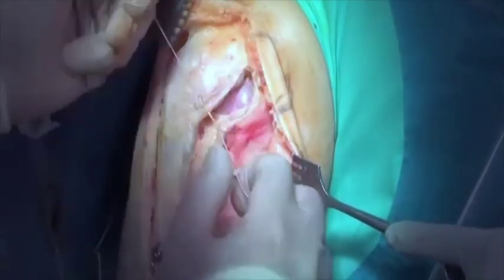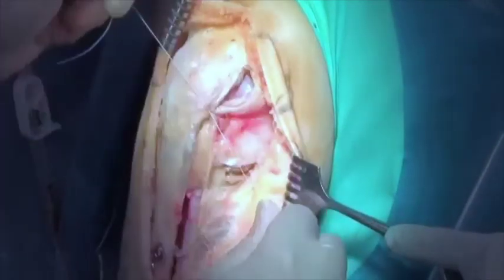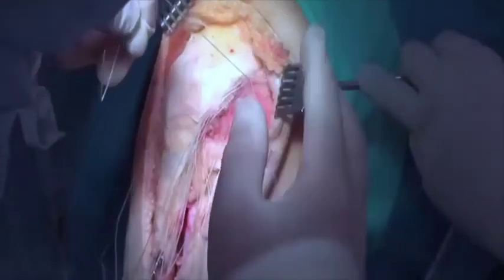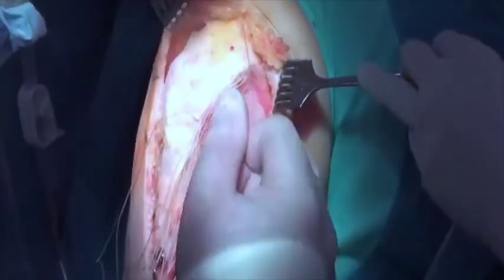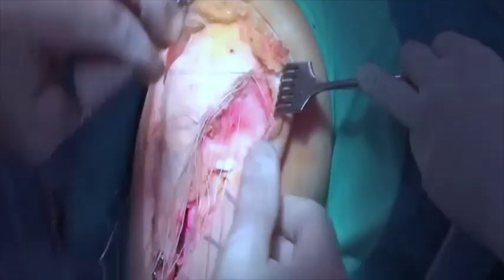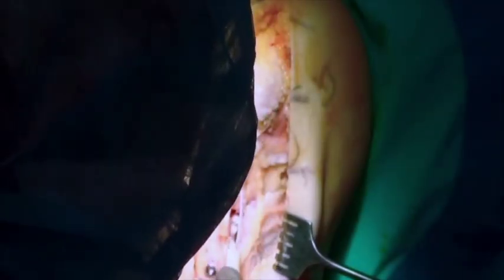Flap closure is performed with interrupted figure-of-eight sutures using number two Vicryl. If possible, the synovium is mobilized and brought up to close any remaining defect. Care is taken not to over-tighten the synovium and thus block full excursion of the patella and patellar tendon. Lastly, the bony defect is bone grafted prior to closure.